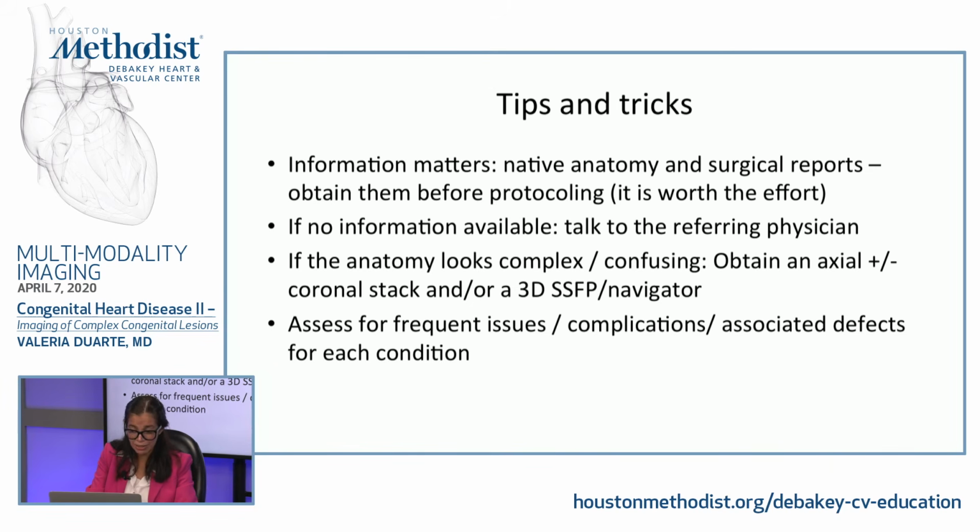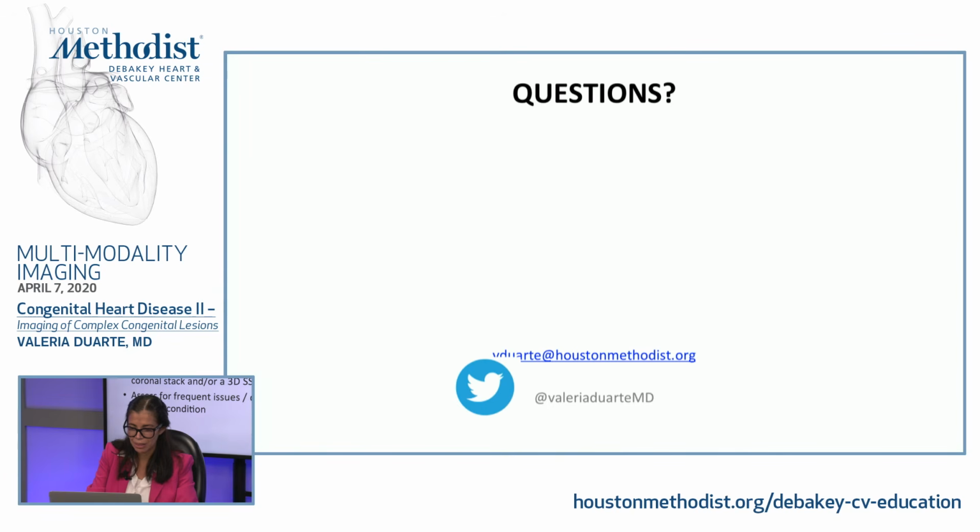Assess for frequent issues, complications, and associated defects, right? Like we discussed the coronary arteries in tetralogy of Fallot.